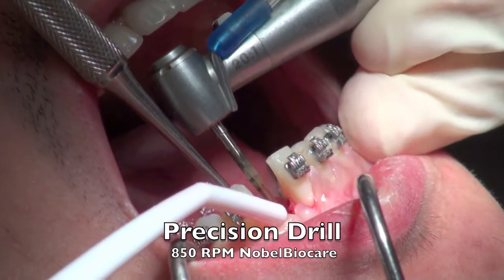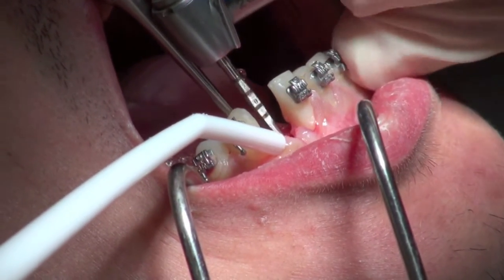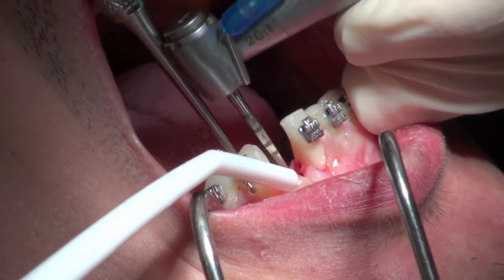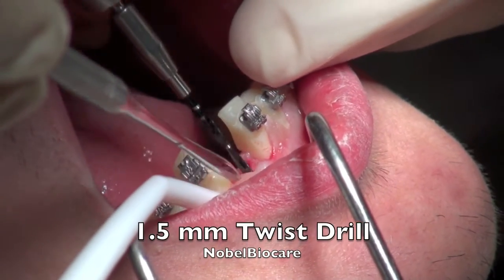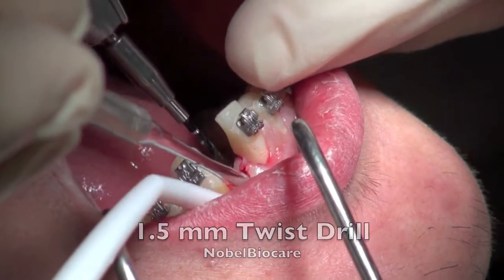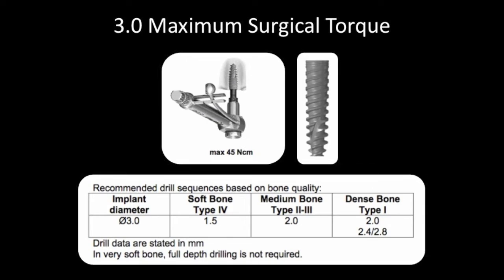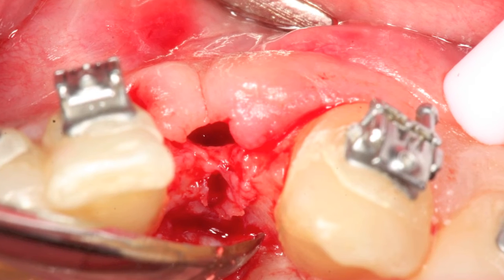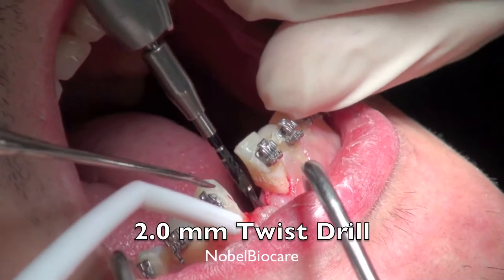The neat thing about this drill is the precision drill is used to allow us to have pinpoint accuracy to start the osteotomy. The protocol for the Noble Active 3.0 is a little bit different in that you use a 1.5 millimeter twist drill to start the osteotomy. Here it was deemed that this is kind of a medium bone type of situation, so I decided I would go from the 1.5 millimeter twist drill, then go to the 2 millimeter twist drill, and then place the implant.